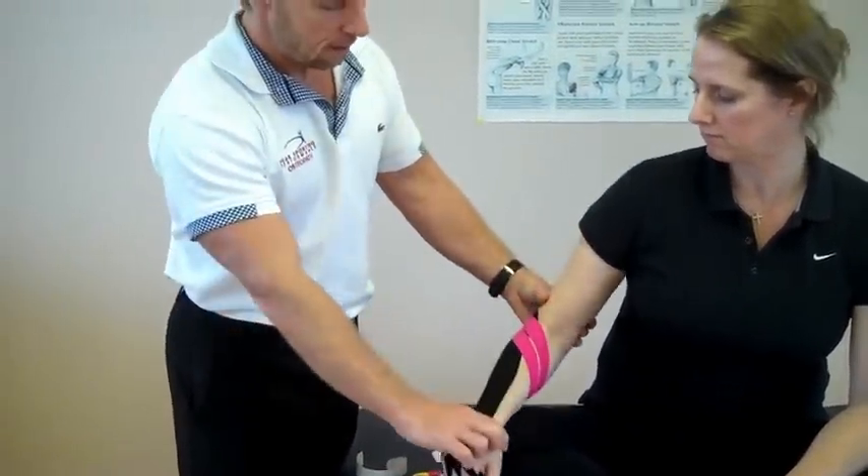And that is kinesiology taping for a lateral epicondyle. Thank you.